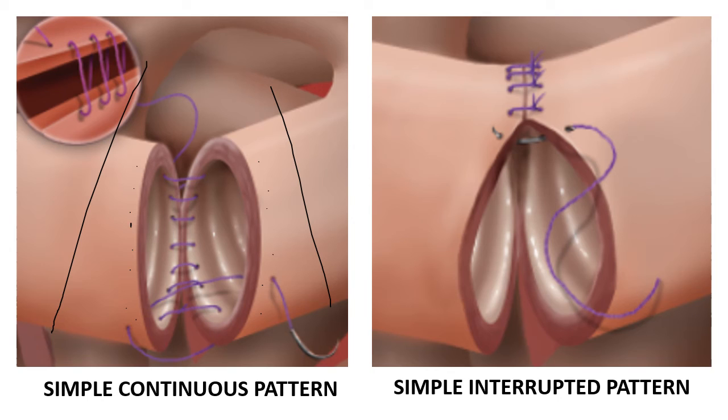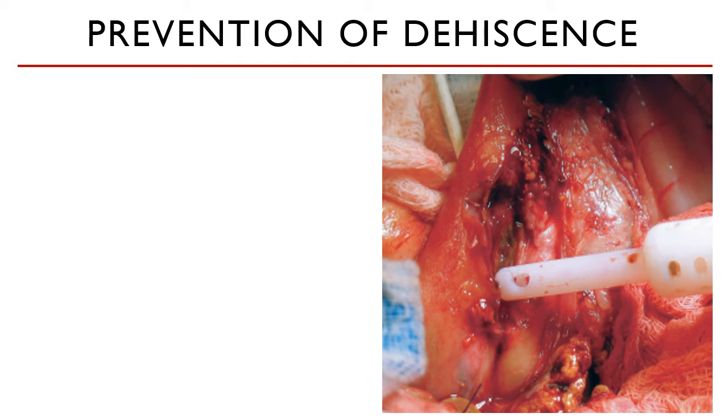After this is done, after you have successfully opposed the two intestinal segments, you have to suture the mesentery with a simple continuous suture pattern, being very careful with the vessels around that mesentery. After you are done suturing, make sure that you check for leakage, and you may proceed to omentalization. Make sure to lavage the surgical site and the abdomen, and count your sponges before you do your abdominal closure.